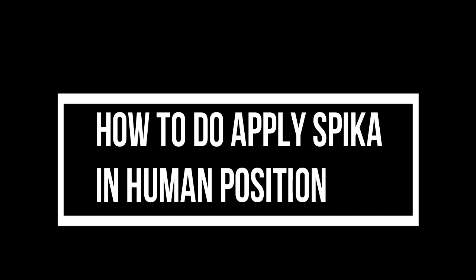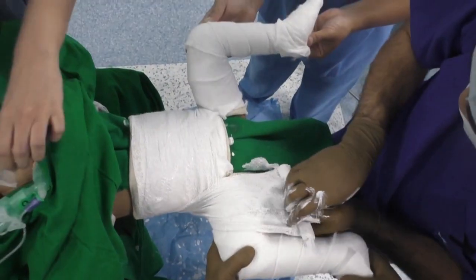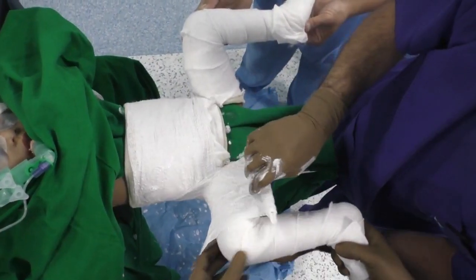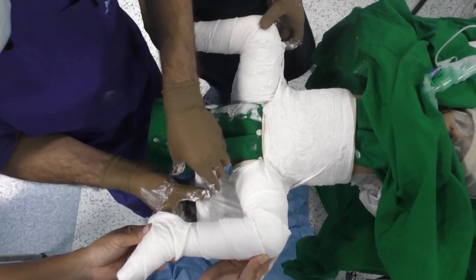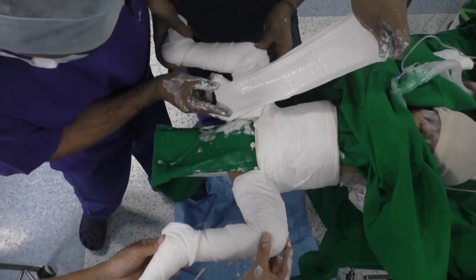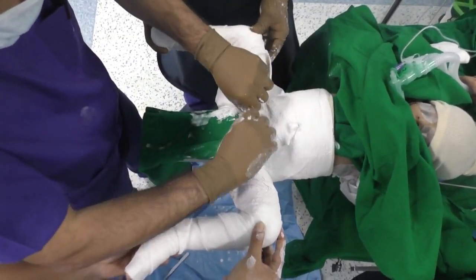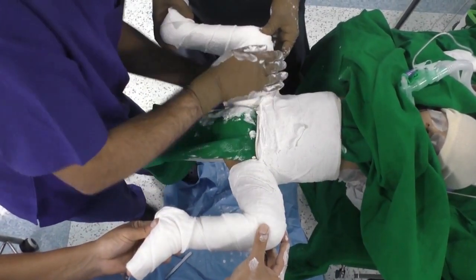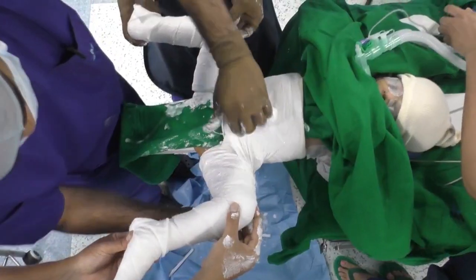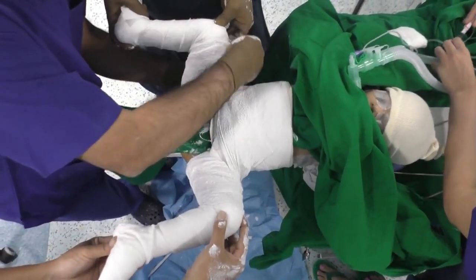Now is the time to apply the hip spica in the human position and we use a wooden board. This child had ligamentous laxity and we decided to apply a hip spica. You start with a single roll of plaster going around the pelvis and around one thigh and the second thigh, and then apply the plaster slabs in a figure-of-8 fashion — first on the right and then on the left — and then secure with another roll of plaster.